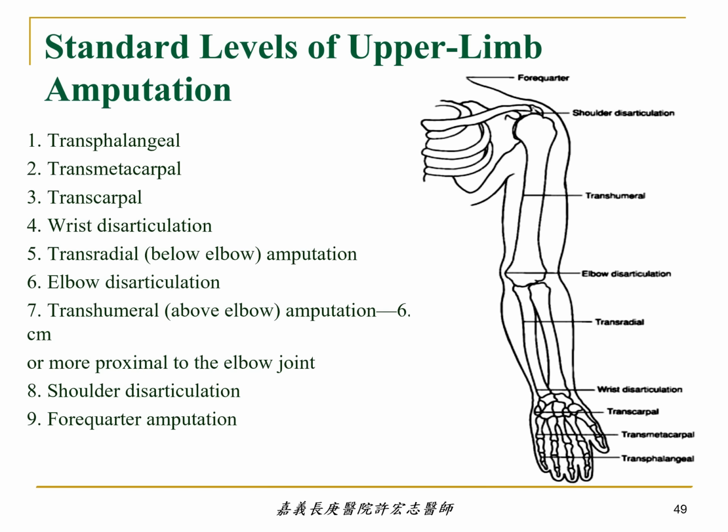With their upper limb prosthesis, if you are using them properly, you can use them to crawl or creep or grab something or play with toys when interacting with others. All of them can help them have a better life.